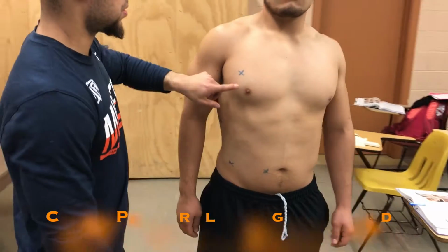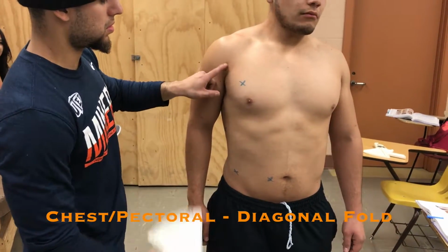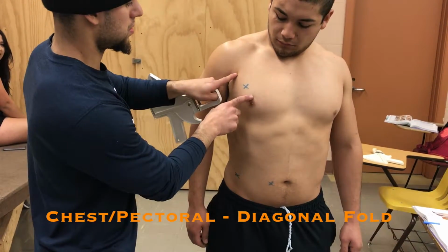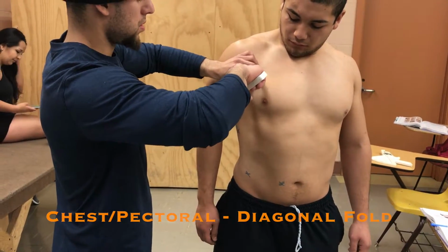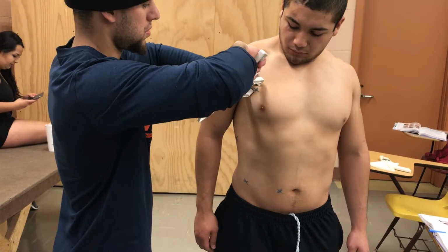Then have the client turn around to measure the chest site. For men, measure half the distance between the anterior axillary line and the nipple. For women, measure 1/3 of the distance. It is a diagonal fold. Obtain the reading, then release after 1 to 2 seconds.